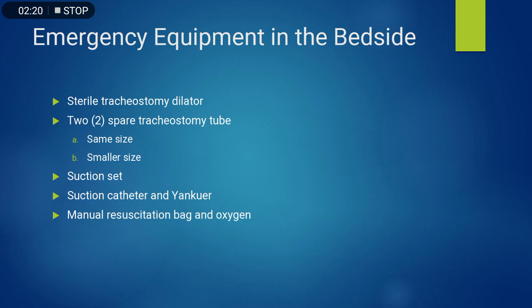Emergency equipment to keep at the bedside. What are the emergency equipment we need to keep at the bedside? Number 1, we should have a sterile tracheostomy dilator. Then 2, spare tracheostomy tubes: 1 the same size as the tracheostomy the patient is on, and 1 smaller size. Suction set, then suction catheter and Yankauer, and a manual resuscitation bag and oxygen.